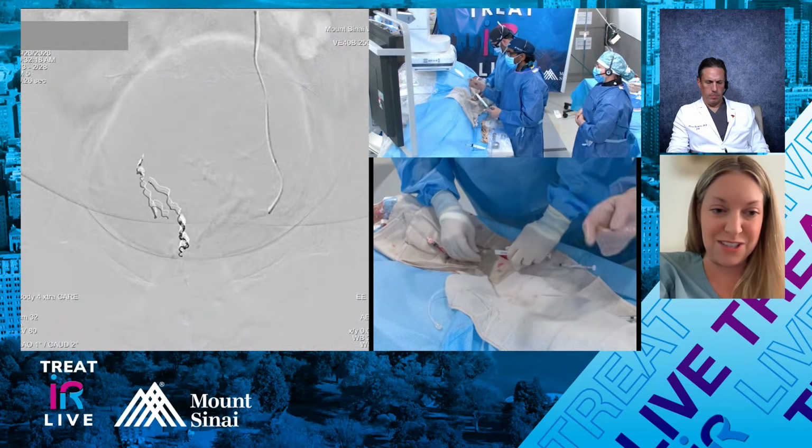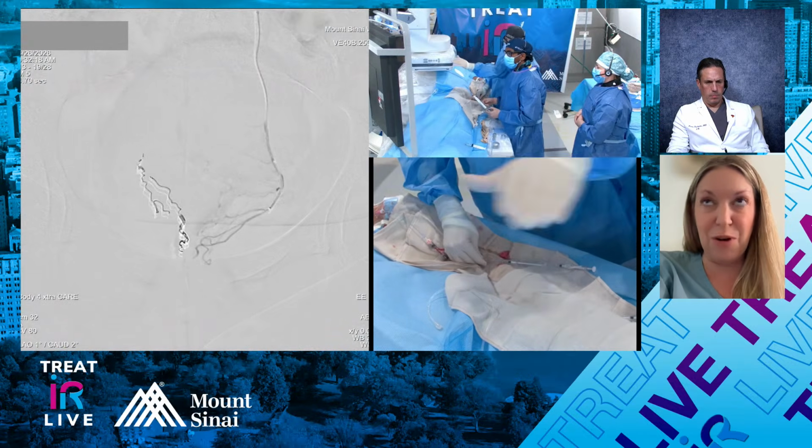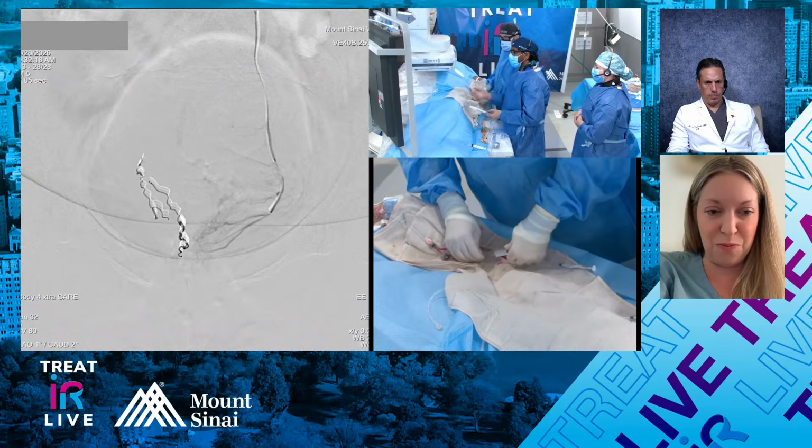Give this a few weeks and see if we get that one past. Yeah, it works, but otherwise it's a nice stratification. You usually want to go into the main one by the time we get them and then down. Yeah, we kind of don't even have to go down.